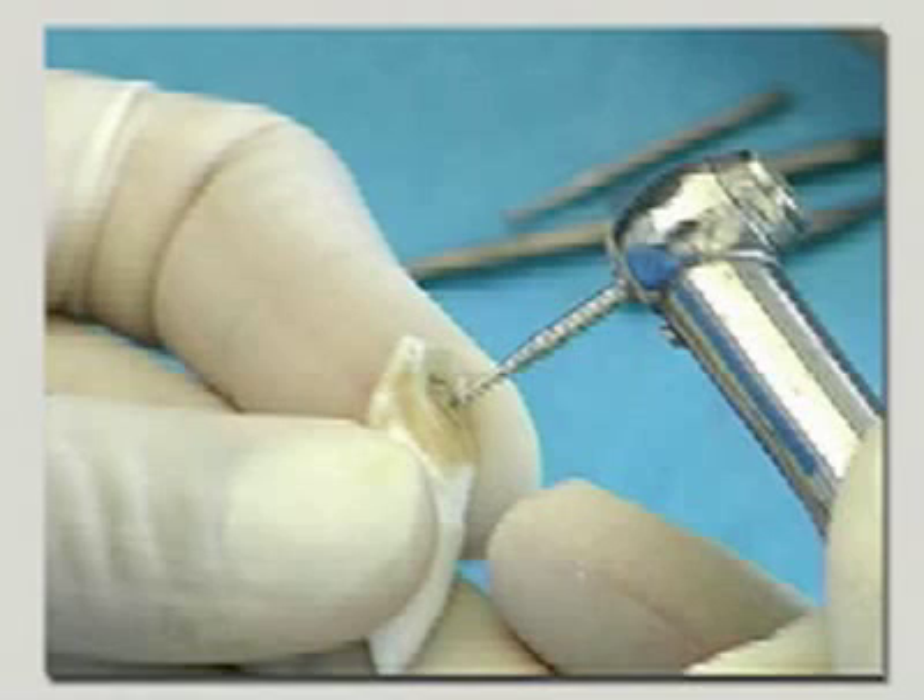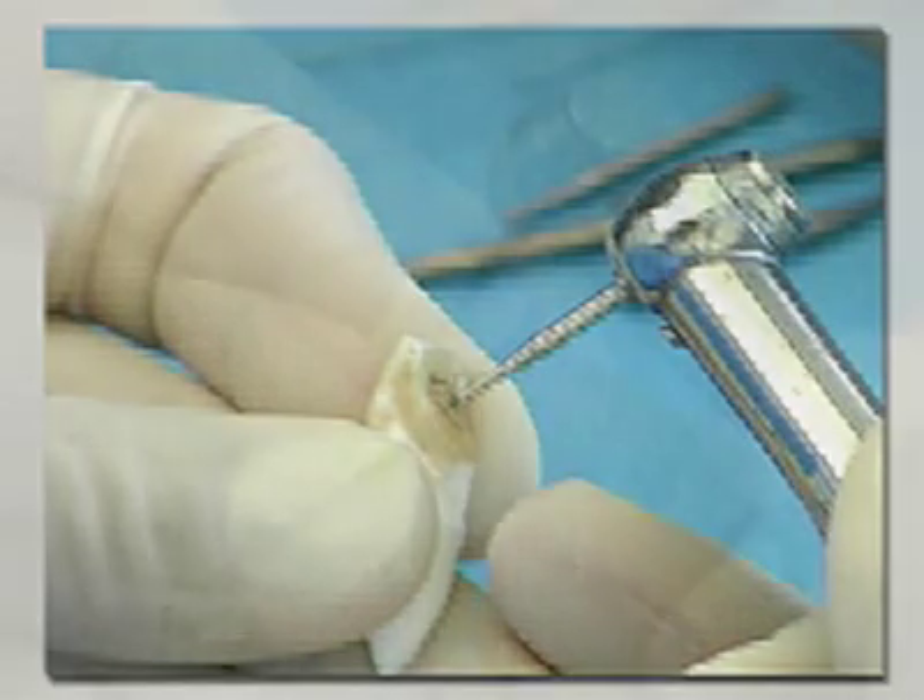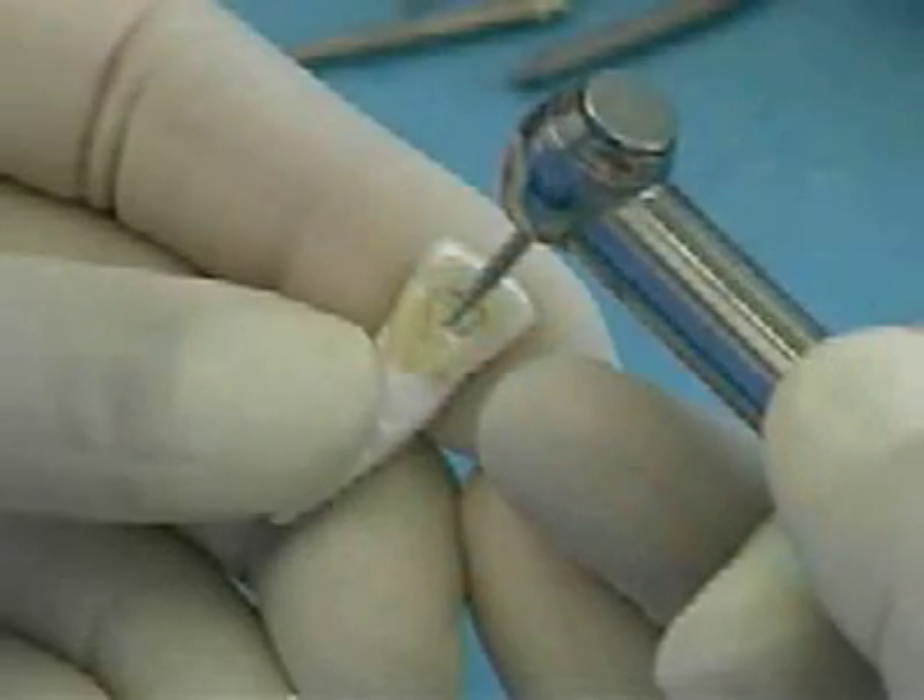Using a high-speed fissure burr or round burr held perpendicular to the lingual surface, cut just through the enamel in the center of the pencil-marked area. Do not force the burr.